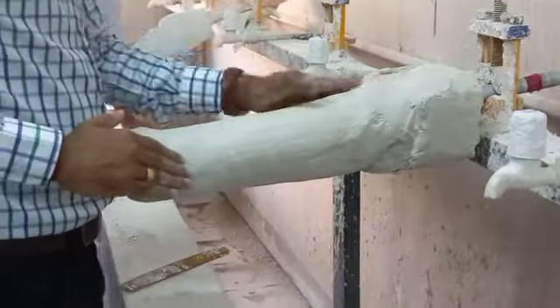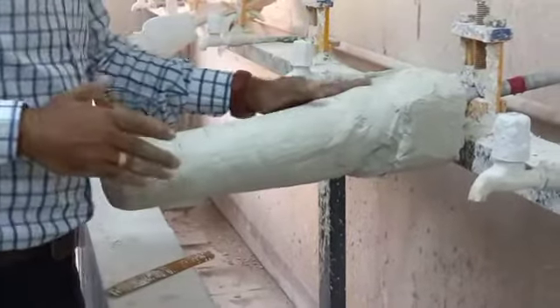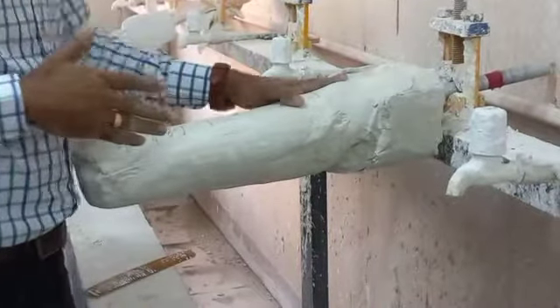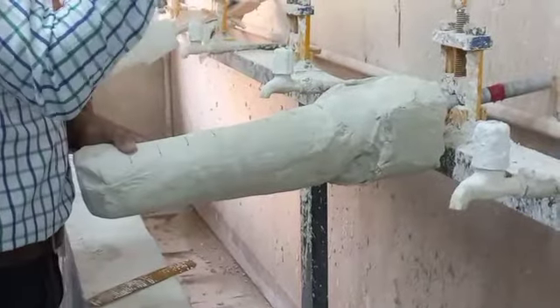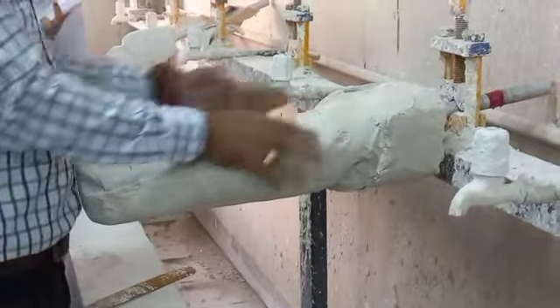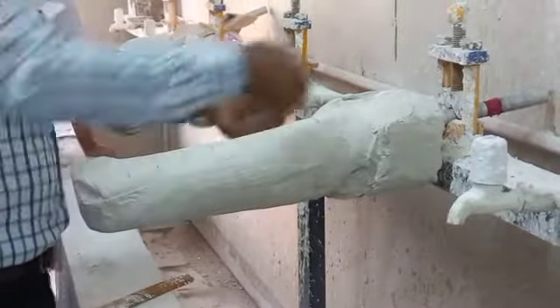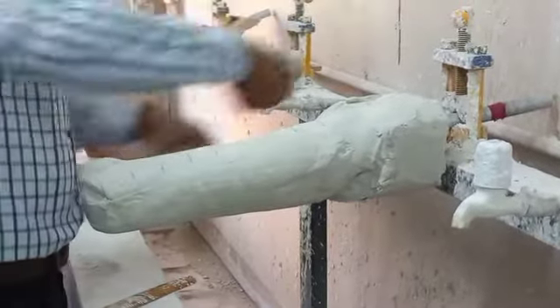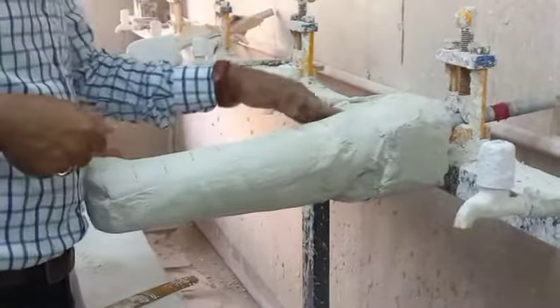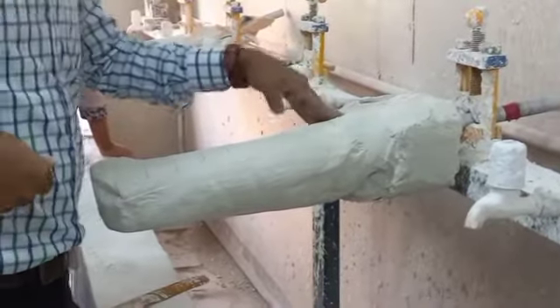Basically we try to reduce in this area because there is a large amount of material, large soft tissue, and in this way we are really de-shaping, right? During the casting this area is also loaded, then you will understand that we are not reducing much, only making it uniform. Otherwise it will appear like we are reducing much, but if during casting you have loaded it at this area, you will find this is very much reduced.